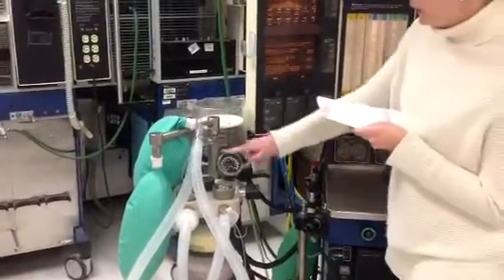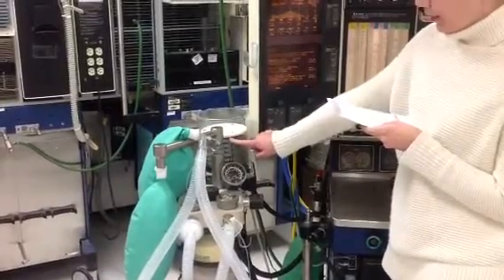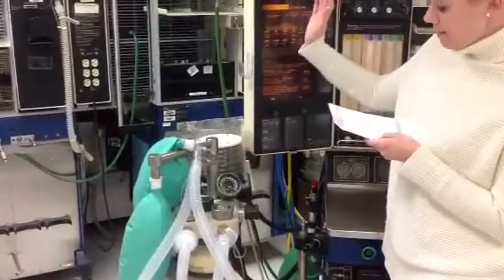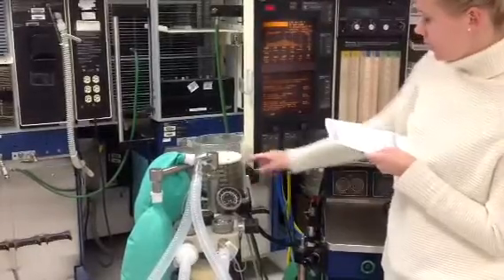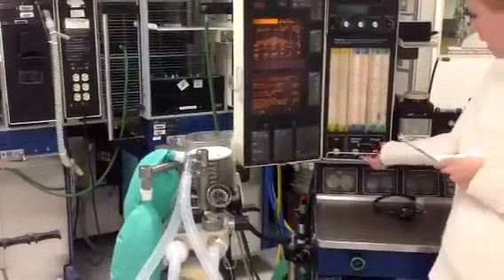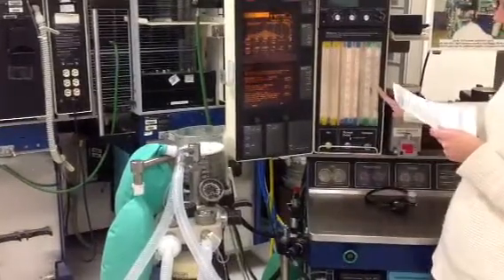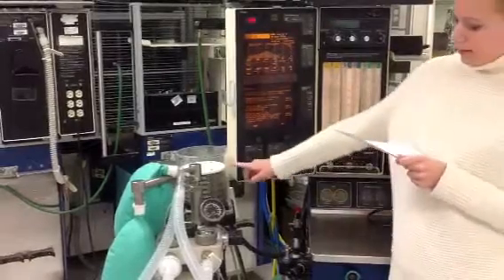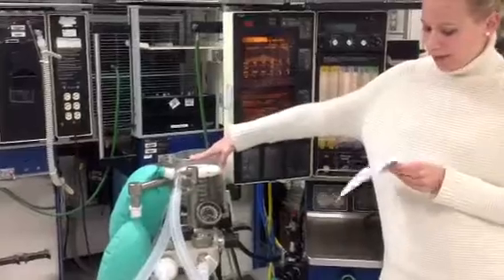Verify that during inspiration, the appropriate tidal volume is given. Inspiration goes down, expiration goes up. And make sure that this fills completely. Set the fresh gas flow to 5 liters. Verify the ventilator bellows and simulated lungs fill and empty appropriately without sustained pressure.